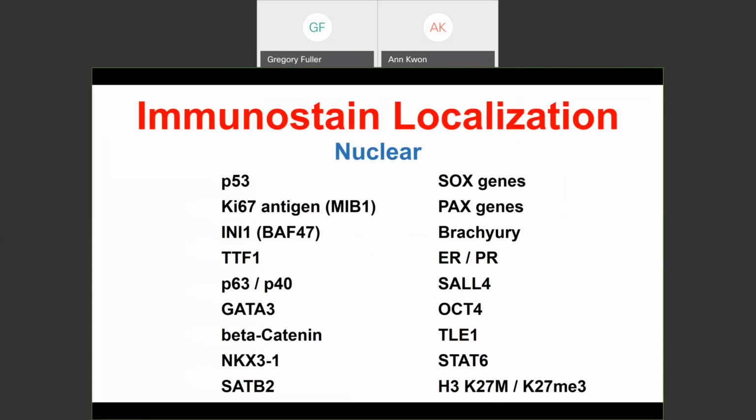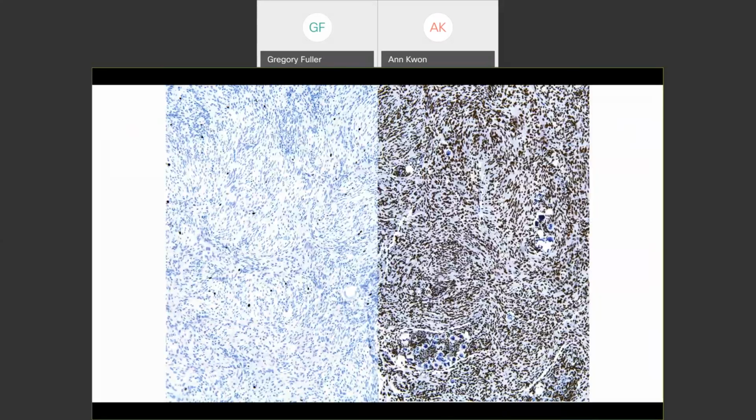There's P53. Look at Ki67. All right, right there, number two on the list, et cetera. This was Ki67. So good job. But for everyone who guessed Ki67 on the left, and it's relevant to prognosis, correct? Yes, it's relevant. It's not the criterion. H&E mitotic figures is the strict criterion by WHO 2016.